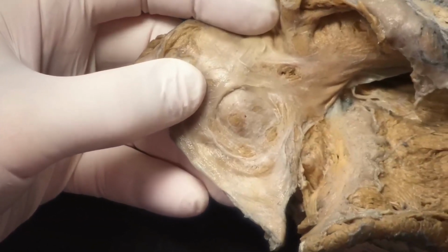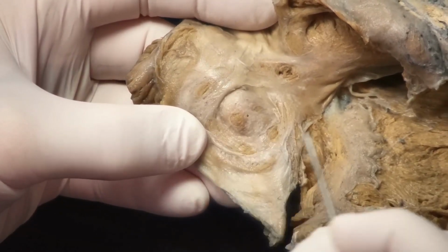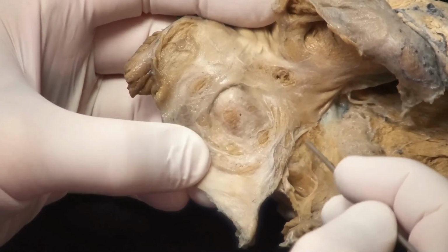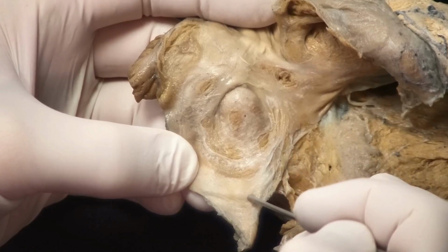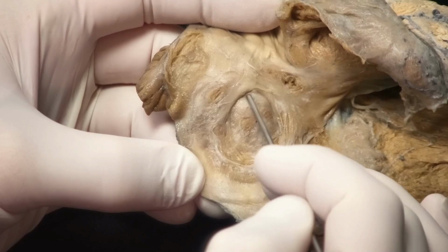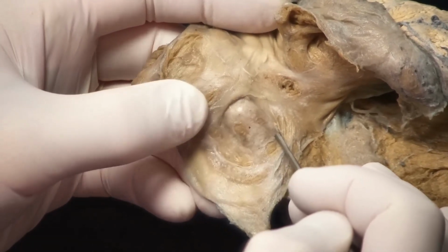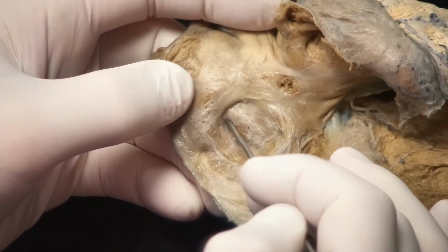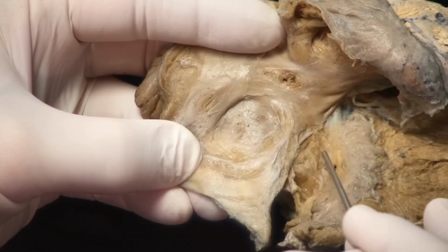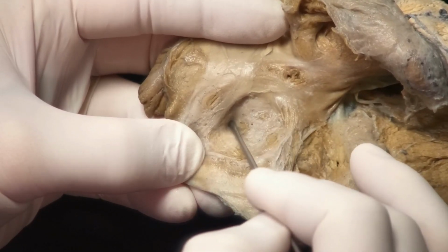Now, if we look at the atrial septum, of course, we have the SVC at the top, the IVC at the base. Here is the tricuspid valve and the coronary sinus just below here, separated by the eustachian ridge. So this is the inferior part of the atrial septum, superior at the top. The region towards the AV valve, closest to the AV valve, is here. And in fact, it's the posterior part of the atrial septum that's going to give you the greatest distance, the best access to the mitral valve on the other side.